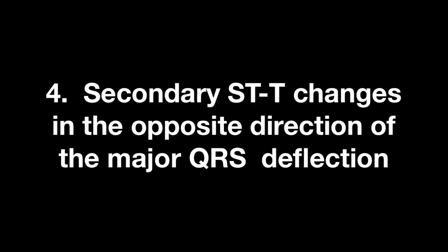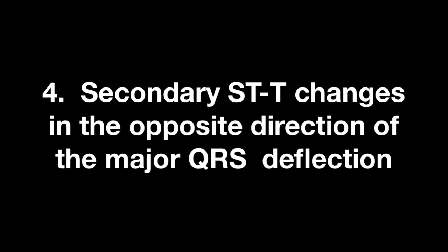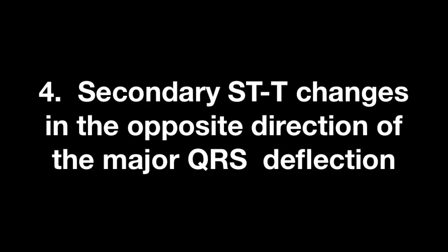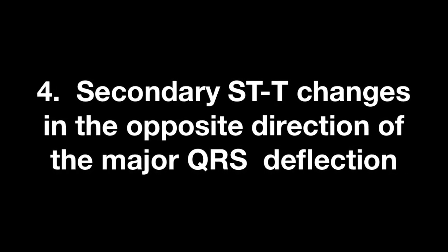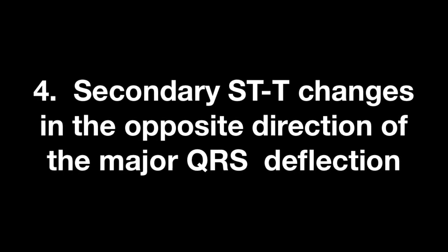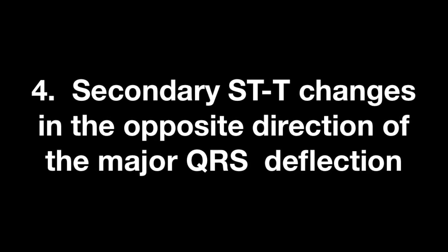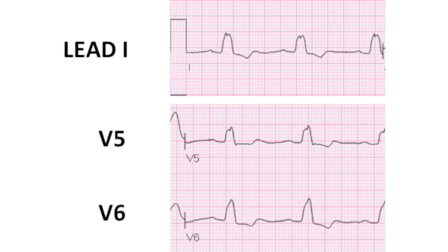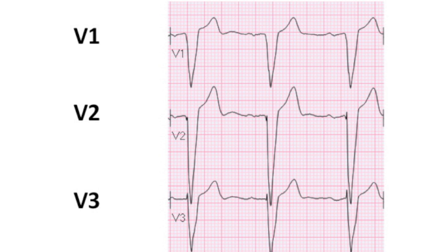The fourth ECG criteria are secondary ST and T-wave changes in the opposite direction of the major QRS deflection. You will see in leads I, V5, and V6 that with the QRS upright, you would expect ST depression and T-wave inversion, whereas in leads V1, V2, and V3, you would expect ST elevation.